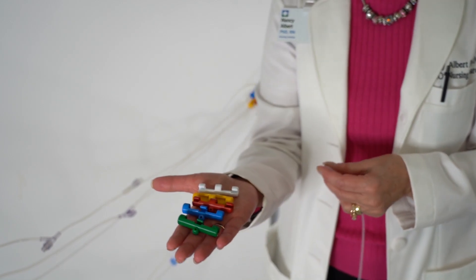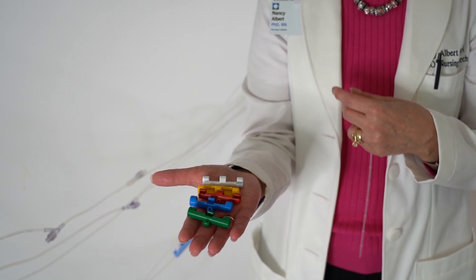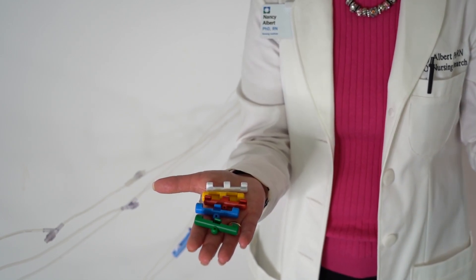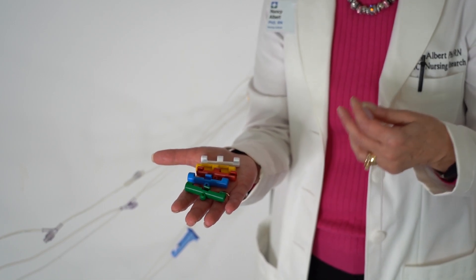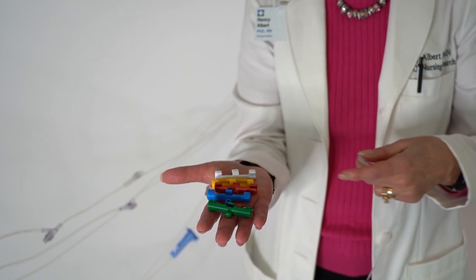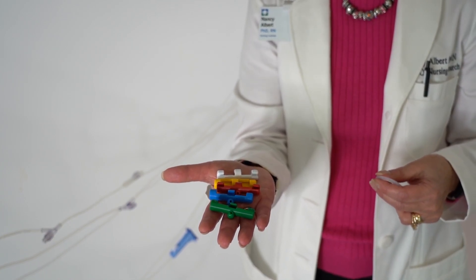There are five different colors of the cradle. So if you want one IV line to have all yellow cradles, you can share in reports that the yellow cradle holds an antibiotic, the blue cradle holds a vasoactive drip, and the red cradle holds some other agent or solution. It will be easy for nurses and other health care providers to follow the track of the tubing to the patient since the tubing is so long.